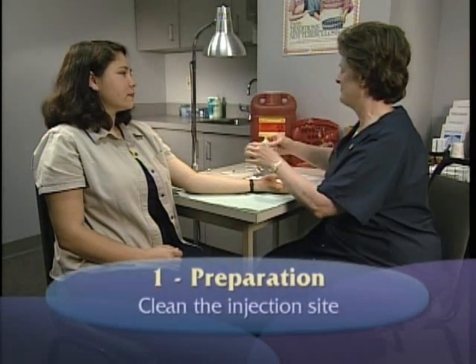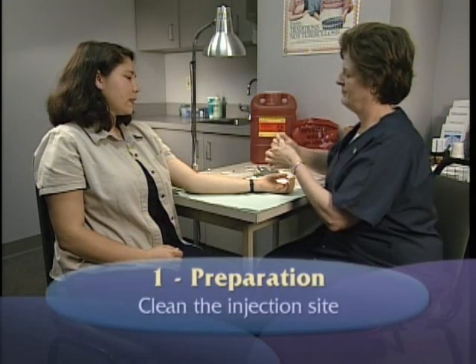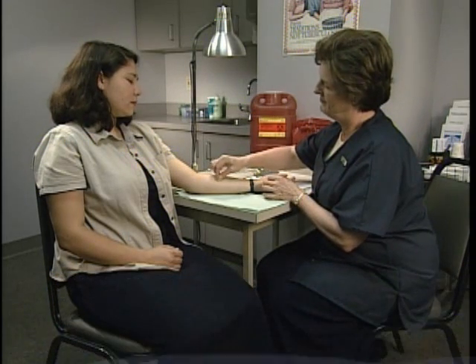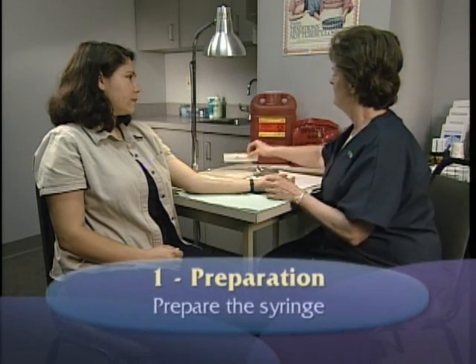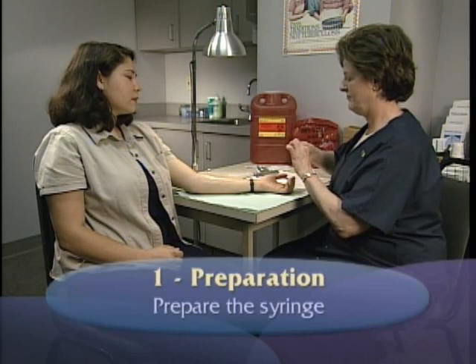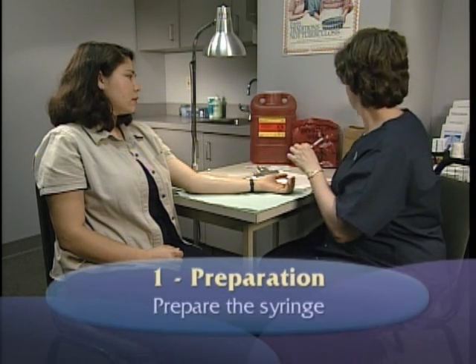After choosing the injection site, clean the area with an alcohol swab by circling from the center of the site outward. Allow the site to dry completely before the injection. Because some of the tuberculin solution can adhere to the inside of the plastic syringe, the skin test should be given as soon as possible after the syringe is filled.